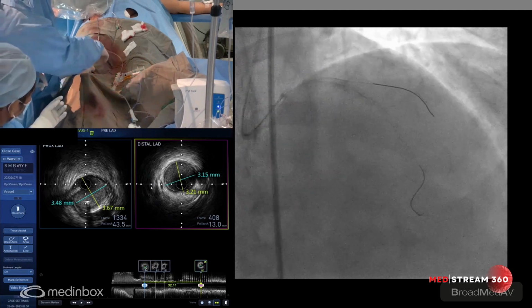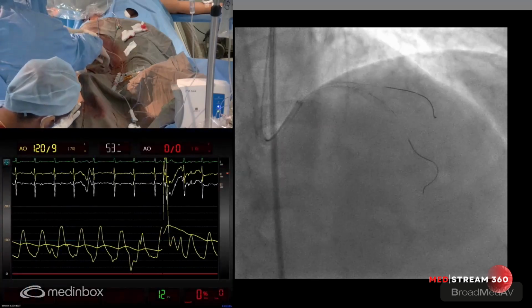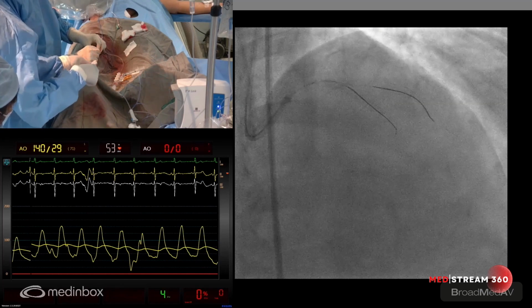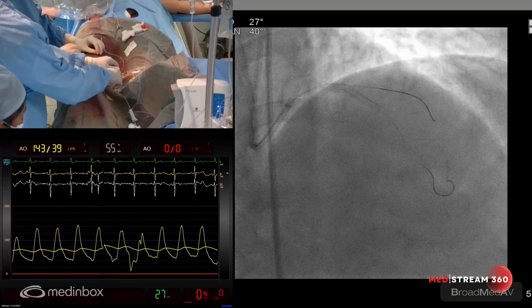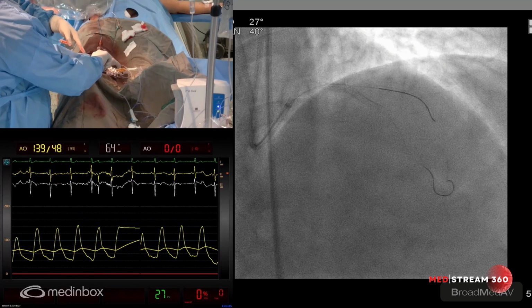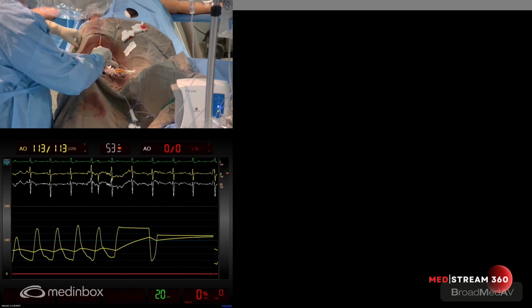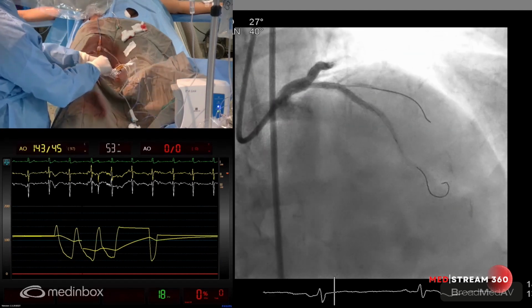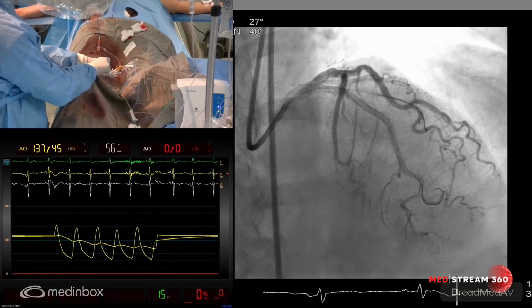Distal LAD averages are about 3.1. If you notice, 3.15 and 3.2. So we'll just have a look at what we did; either we can take a 3.0 or 3.25, go a little high pressure distally. Aspirate. Air. Okay, so you can see that the stent is nice and uniformly expanded.